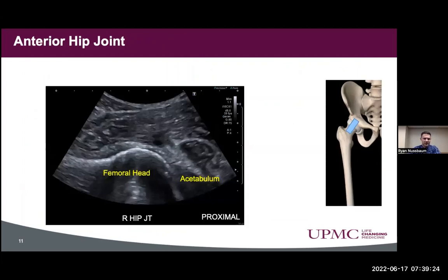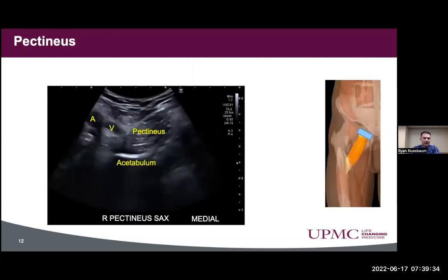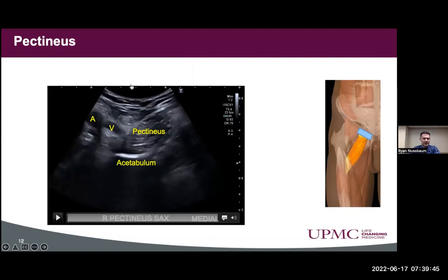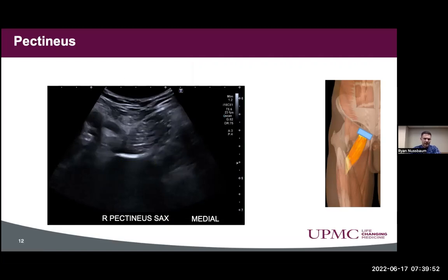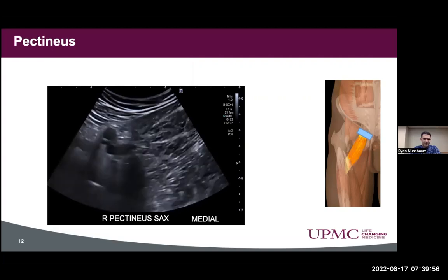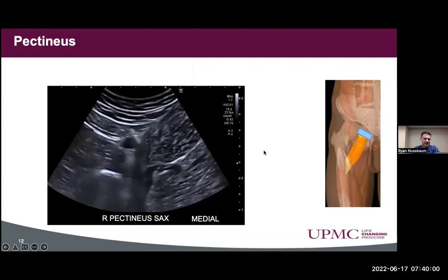We started with the hip joint and viewed the femoral head and acetabulum. We weren't seeing any effusion or cortical irregularity on this view. Next, we looked at the pectineus. To find it, locate the femoral artery and vein and move more medially — the pectineus will be right above the acetabulum near its origin, making its way over to the proximal femur. Acoustic enhancement through the vasculature makes it a little challenging to see, but for this athlete, the pectineus muscle appeared normal.